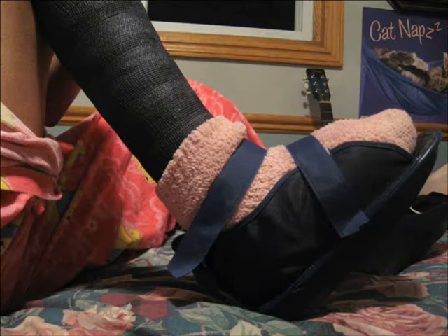Hi everybody. Today I'm going to be showing you how to put on this shoe, and I'm also going to be showing you how to walk with two crutches, one crutch, and just without crutches as well, because I know that can be hard sometimes.